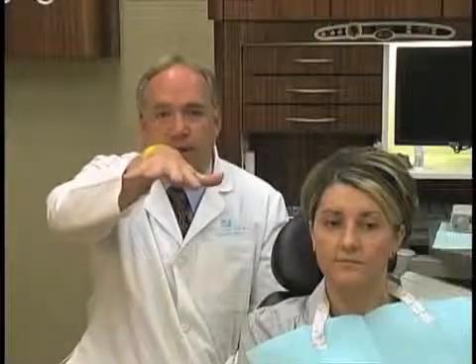The second thing that I think is really misunderstood, and really important in aesthetic dentistry, is the understanding that the maxillary cast has to be hanging on the articulator precisely how the maxilla is hanging in the patient's head. There are lots of times we see people whose maxillary planes are canted. And if we don't have an accurate depiction of that, when it comes time to waxing the case up, if we just hand articulate those models, it's very likely that we might straighten it on the articulator, wax things up, and we put it back in the patient's mouth with the provisionals, and the cant exists.